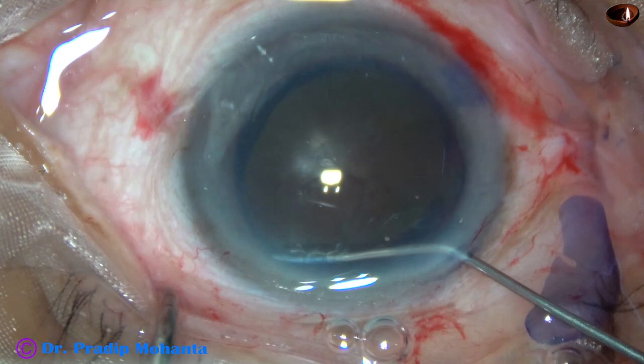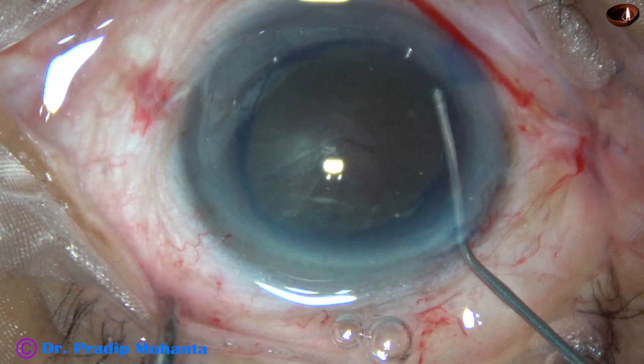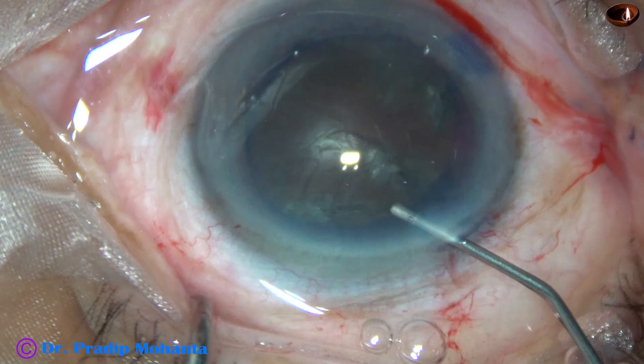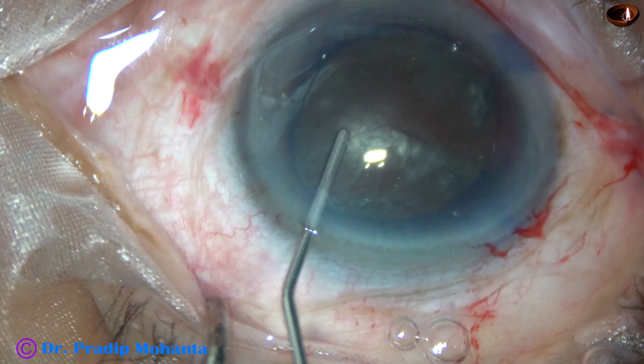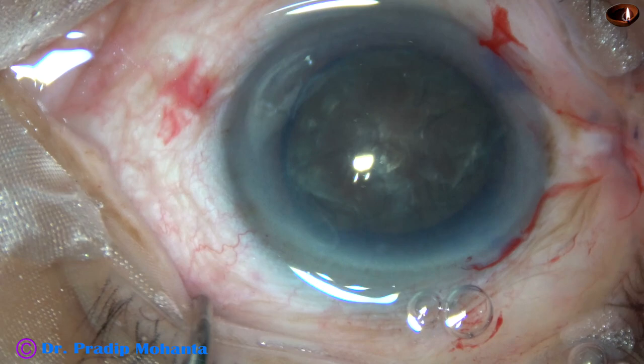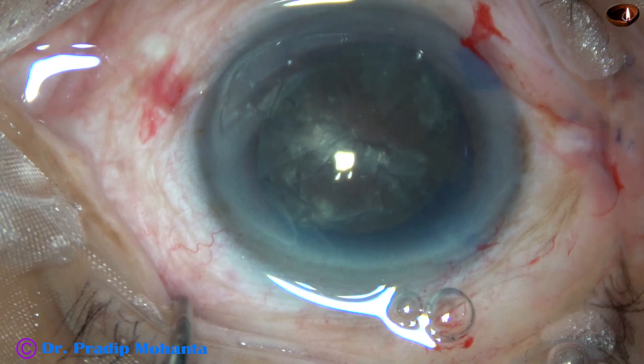Now hydrodissection has to be done very carefully. We cannot inject a lot of fluid at one place. Small amounts of fluid have to be injected at multiple places. The nucleus is tapped very gently and fluid is injected over the surface of the cataract. Fluid is injected at around 5 o'clock. The nucleus is moving and it is free.